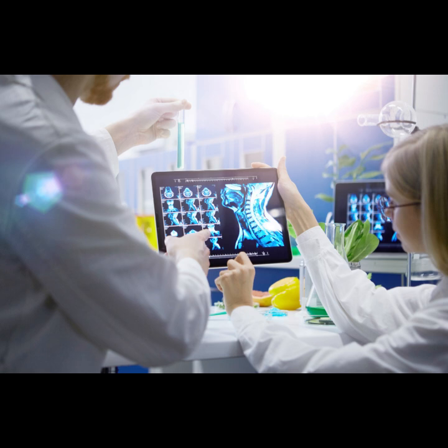Okay, signal acquired, but then relaxation kicks in immediately. Right, immediately. The party's over. The system wants to get back to its low energy state aligned with B0. Two things happen simultaneously. The magnetization along Z starts to regrow. That's T1, or longitudinal relaxation. And the signal in the transverse plane? It starts to decay. The individual proton spins get out of sync with each other, and the net signal in the XY plane cancels out. That's T2, or transverse relaxation.